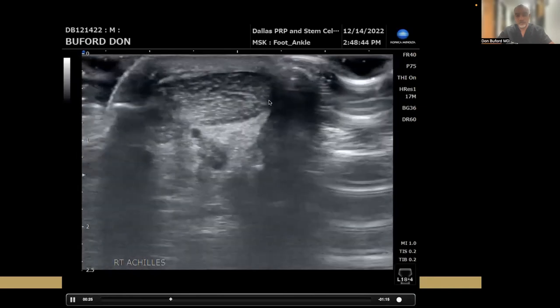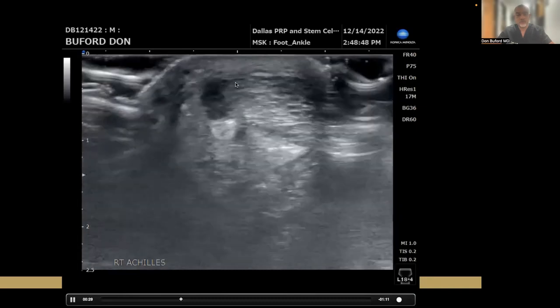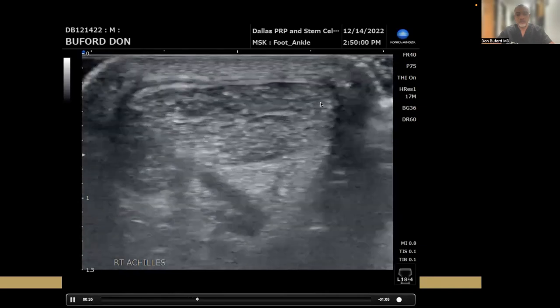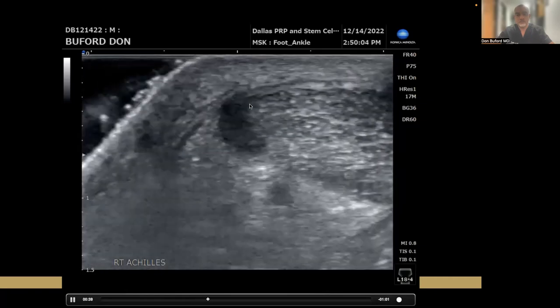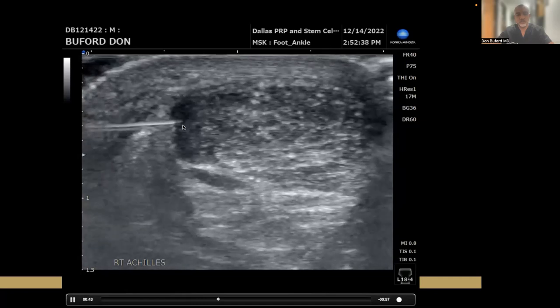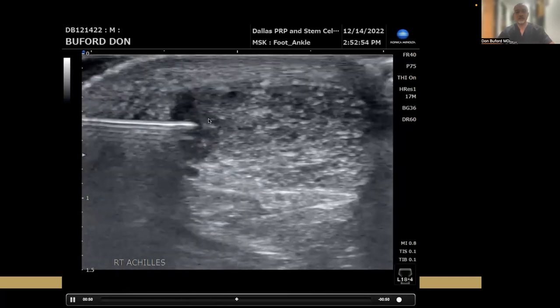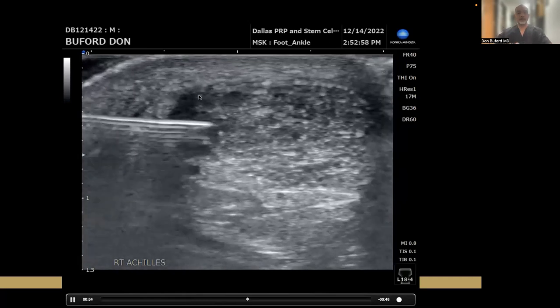So this is where the pain is. When you look at the lateral side, you can see these fibers have a normal appearance. When you look medially, you can start to see the tearing in the medial aspect. Here we've enlarged the view. Laterally, the tendon looks pretty good. Medially, when we go to the area of maximal pain, you see this hypoechoic region. Here's the needle coming in — this is a 25-gauge needle, a medial approach. We're going to needle the tendon multiple times, and then inject our PRP intratendinous and also a little bit peritendinous.